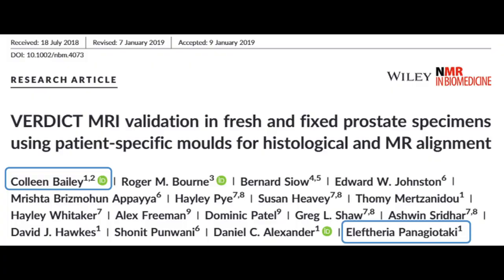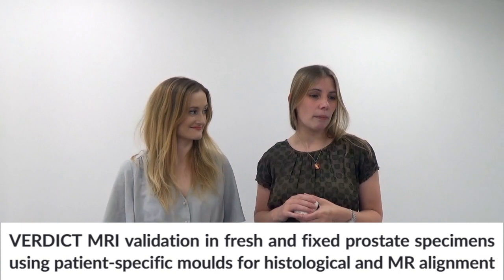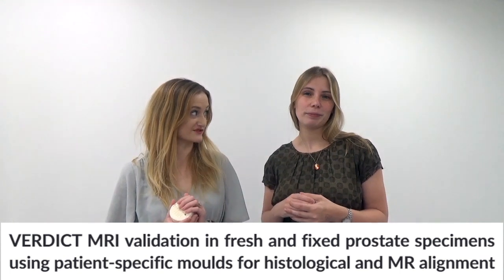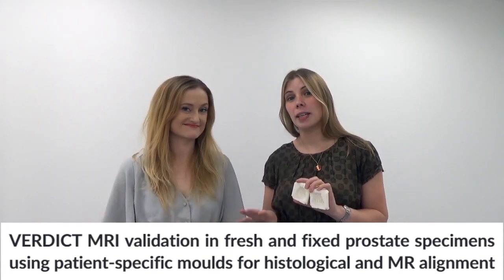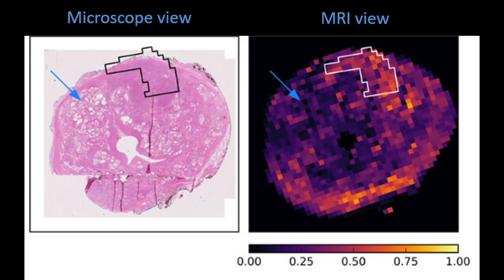The second paper is by Colleen, who does a lot of this work. It's called 'VERDICT MRI validation in fresh and fixed prostate specimens using patient-specific molds for histological and MR alignment.' MR is just shorthand for MRI - magnetic resonance. VERDICT is a new, fancy type of MRI that our collaborators have developed. As well as just doing the normal imaging, they have an extra special new mathematical way of imaging that's meant to be more descriptive of the actual molecular biology underneath. This paper is actually doing some of that registration - comparing the images that a pathologist traditionally looks at when diagnosing cancer with the MRI images, trying to align them and understand what's going on.